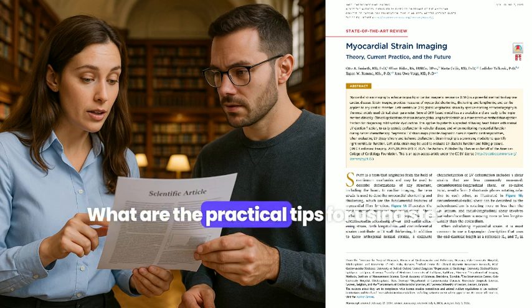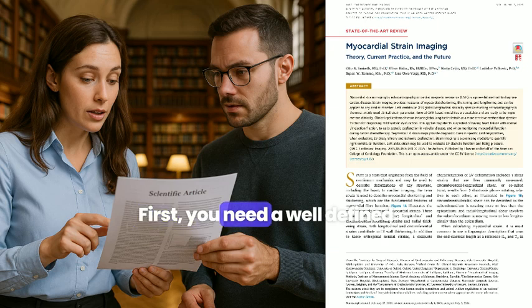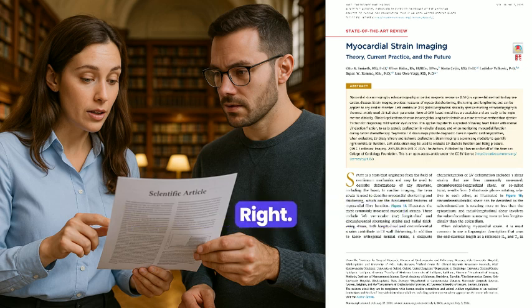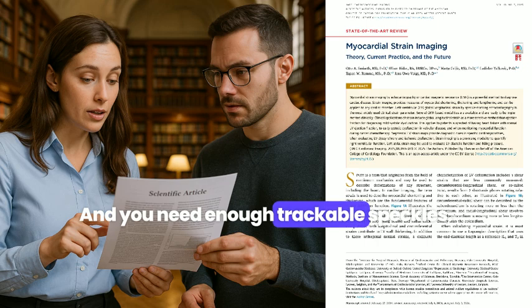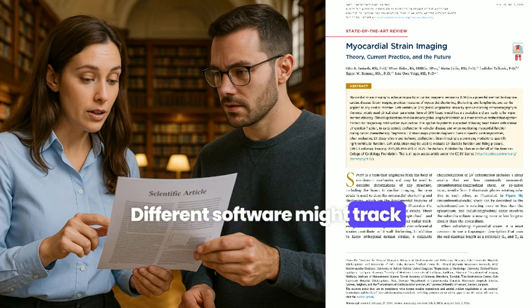What are the practical tips for using STE? What do we need to watch out for? Good question. First, you need a well-defined region of interest, the ROI. Usually you want the full wall thickness. Not just the inner edge. Right. And you need enough trackable speckles, basically. Decent image quality in that region. Different software might track slightly differently, too.